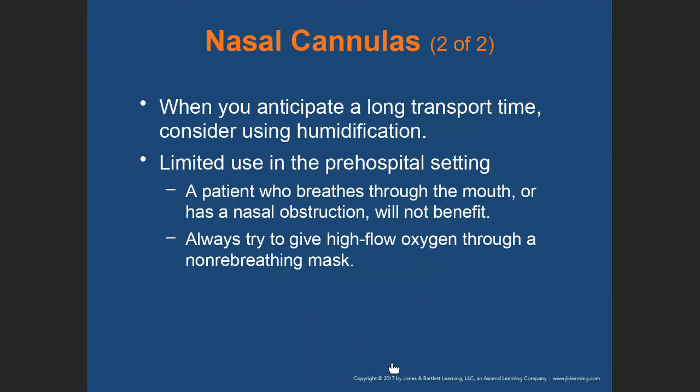So in the pre-hospital setting, if we need to give the patient humidified oxygen, we start them on dry oxygen first. When we get to the unit, then we put them on humidified oxygen. So we don't give humidified oxygen in the field unless the patient is stuck and requires it, or there is a long distance between the patient location and the unit. Outside of that, it's dry oxygen until we get to the unit, then we give the patient humidified oxygen.